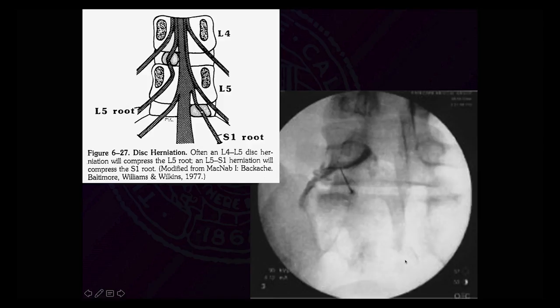What you can see with regular x-ray is bone. So you really can't see nerve directly. You can see it indirectly by knowing where the nerve might be. So here's a diagram that shows the vertebral body. Here's a bridge off of that body called the pedicle, and the nerve always travels underneath that. Here's a little disc that's causing a kink in the nerve that's traversing below. So here we can see in this x-ray, here's the pedicle I was talking about. So since we expect that the nerve should be right under the pedicle, with x-ray we can place the needle there and we can put a little dye, and that nicely outlines the course of this nerve. So we're seeing it indirectly that way. So many times patients will have injections that can be very effective, and they're done by placing it where we think the nerve should be under that pedicle.